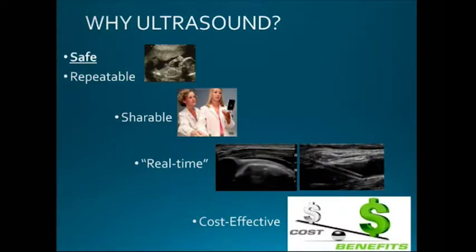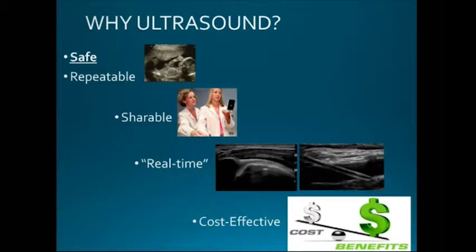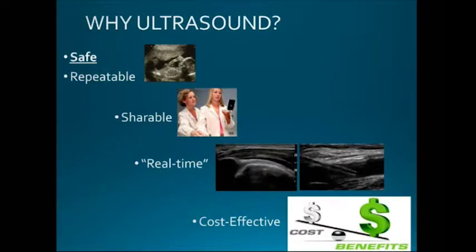And that's useful from a teacher-learner standpoint, but also from a consultative standpoint. A lot of times it's very nice for me to go to a consultant and say, hey, here's what I see. This is why I'm consulting you for this particular concern, and they can see what I can see. Most of the time they're like, yeah, I agree, but sometimes they might say, well, your plane of cut here might not be exactly on, let's do a formal study or let's think about other things.